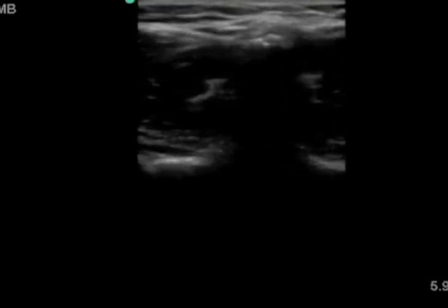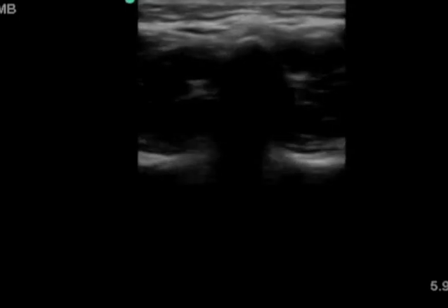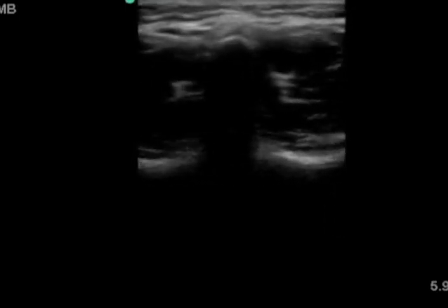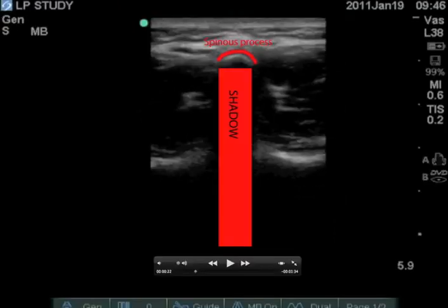Now you need to find the spinous process and center it in the middle of the screen. This will appear as a hyperechoic rim with shadowing behind it. You may need to make some small adjustments up and down and side to side with the probe in order to get this image centered in the middle of the screen.